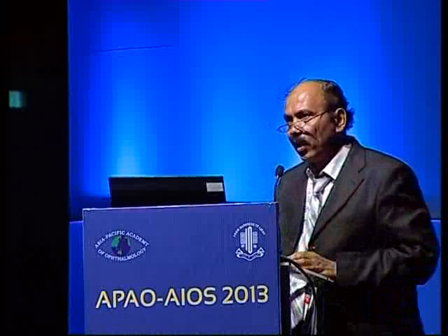A single instrument will measure K, ACD, and axial length, and you can personalize your own lens constant by measuring 20 or 30 of your own surgeries with a particular lens. So you can alter the lens constant. This is especially useful in staphylomatous eyes, high myopia, silicone-filled eyes, and post-refractive surgery. The disadvantages of the IOL Master are dense cataract, PCO, nystagmus, and poor fixation.